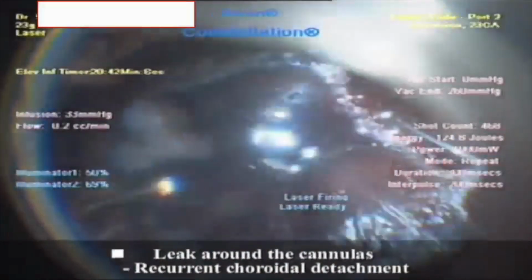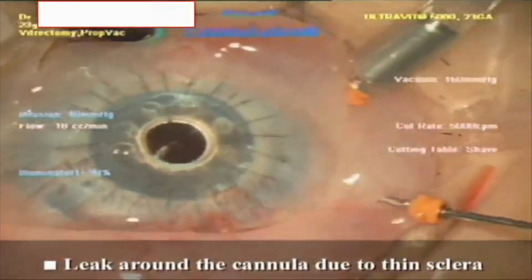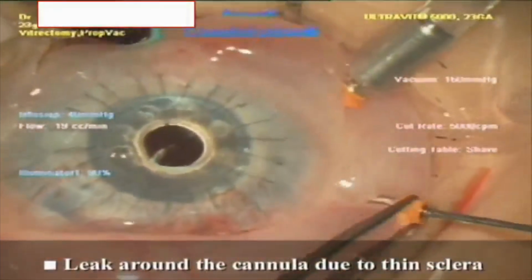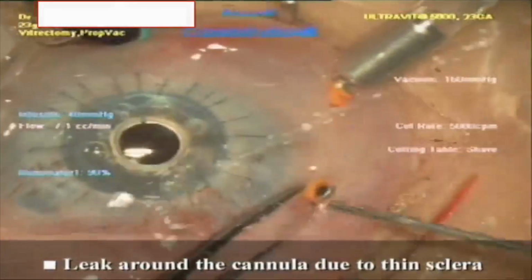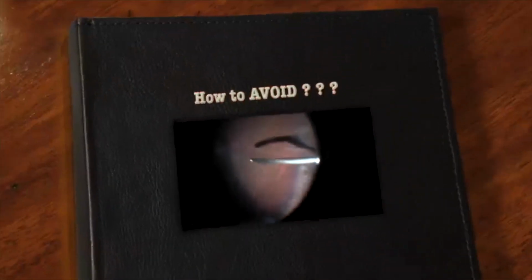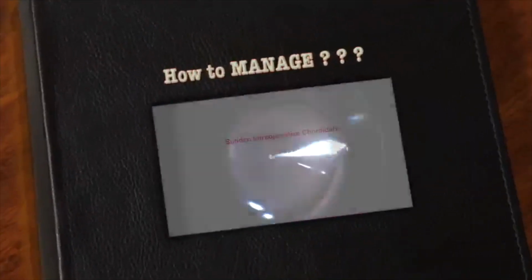Recurrent choroidals can also be due to leakage around the cannulas in eyes with thin sclera. But sudden intraoperative choroidals call for individualized logistic approaches: how to avoid it, prevent it, and manage it.